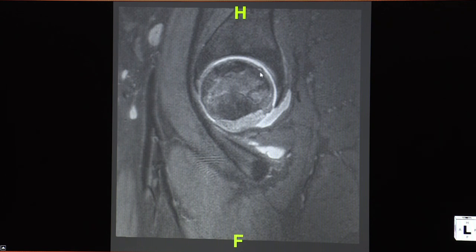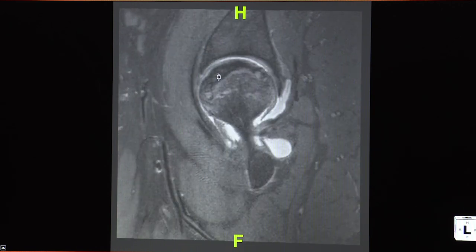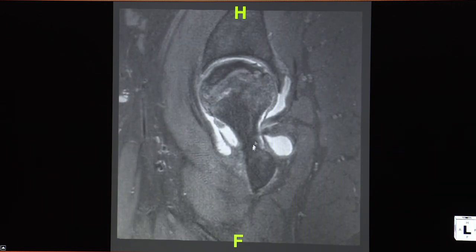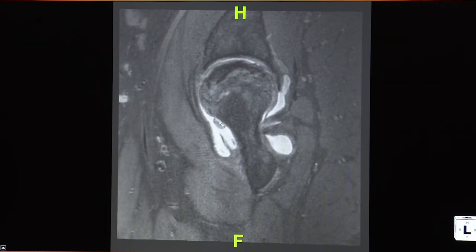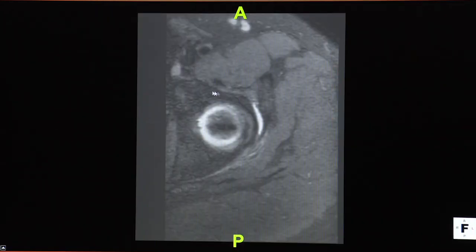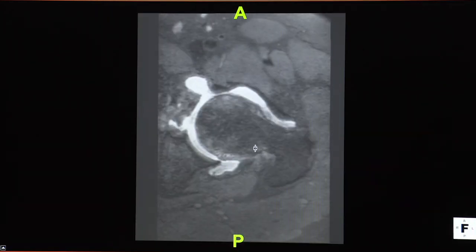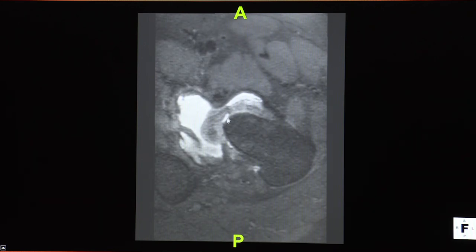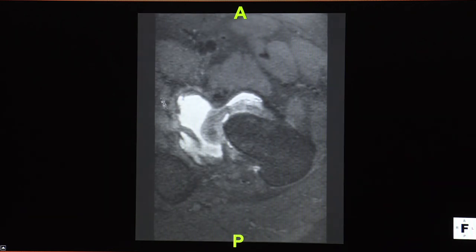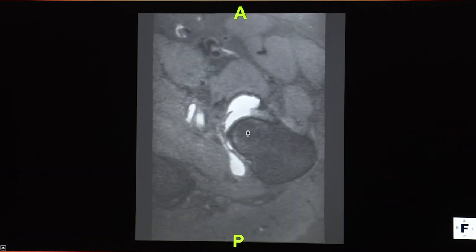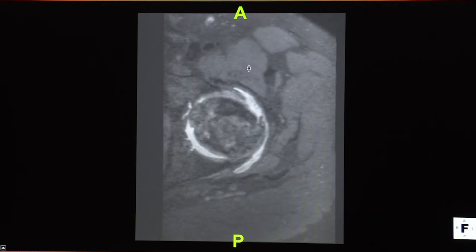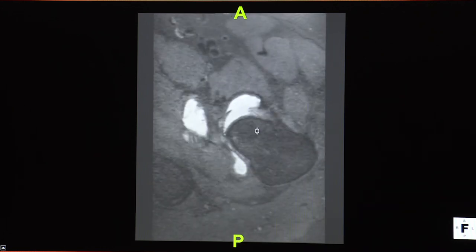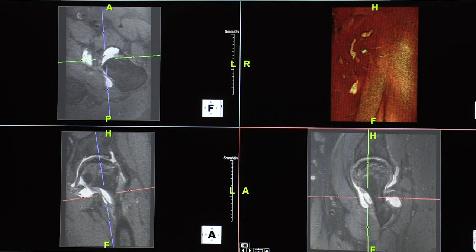You can see the cartilage swelling — the blister in the bone — the AVN, bone marrow edema, and the labral tears. This gives you everything you need in a hip. Here are the plicae on either side with all the synovial thickening. On axial images scrolling down, the synovial thickening is quite prominent — sometimes so prominent you may think the patient has PVNS, but it's just synovial thickening from chronic irritation and AVN. That's how we do 3D processing of the hip, measure labral tears, and provide the report to the surgeon.